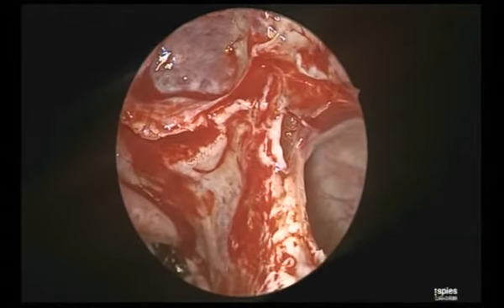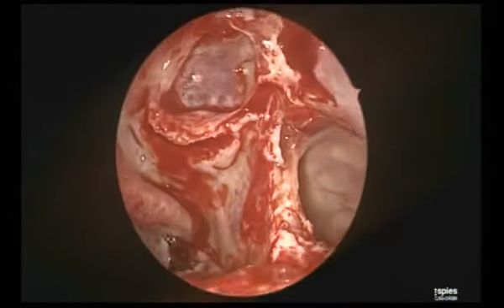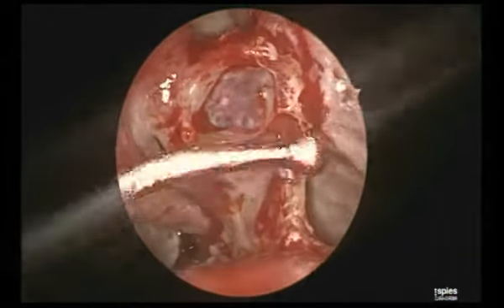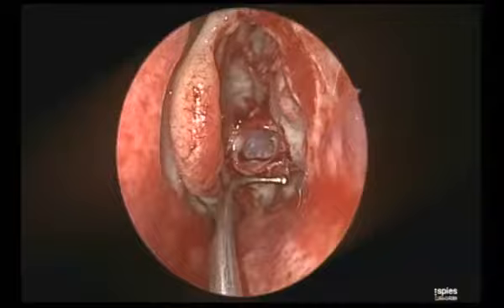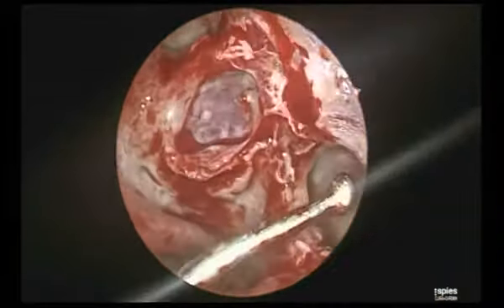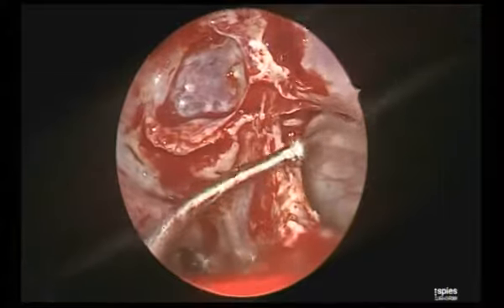I told you this is the surgery of landmarks. You have to move by the landmark. I want to see the roof of the maxillary sinus. This is very important surgically, to identify not just the uppermost level of the maxillary ostium widening, but to go to the roof. The landmark is the roof of the maxillary sinus, the superior wall. This is the roof of the maxillary sinus. To delineate that, I clear my infraorbital cell at this point of time. That is why he got the Haller cells also out.